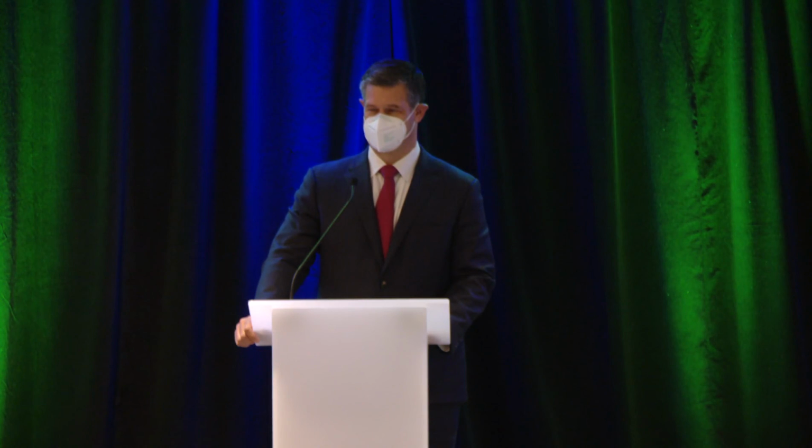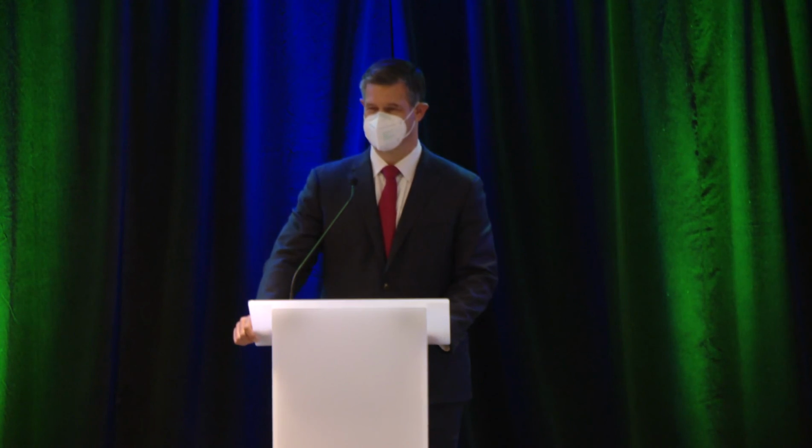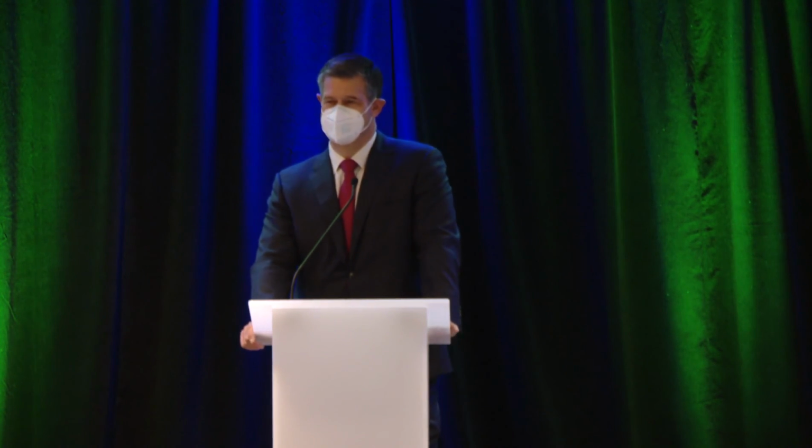I have a lot of problems with the distal latency. It was an attempt by Chicago to use pressure measurements to imply peristalsis. So what do you do with an impedance swallow that is read as premature by the HRM, but the impedance is normal? That becomes particularly important in diffuse esophageal spasm. I don't like to read spasm because there's not much I have to offer in spasm, but what do you do when you've got these premature contractions and you have normal bolus clearance? I'd like to hear from the young people, or the various labs, how they're playing that out.